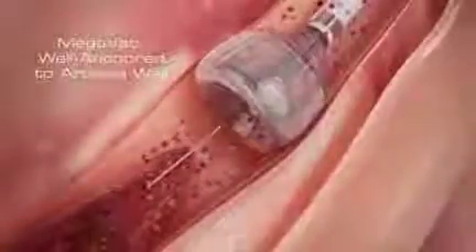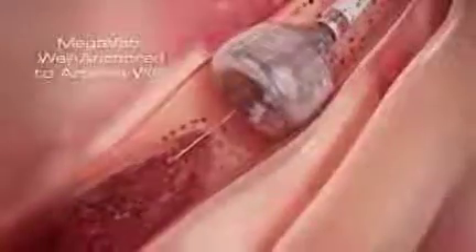The outward expansion of the MegaVac anchors and centers the device, and can be used as an anchor for other devices in crossing tight lesions or tortuous vessels.